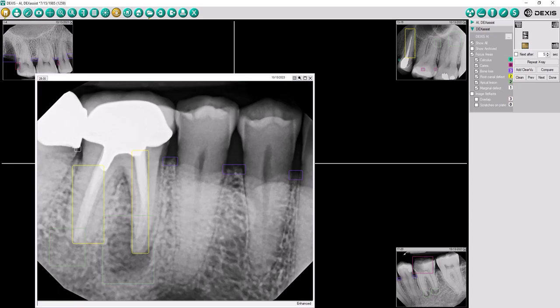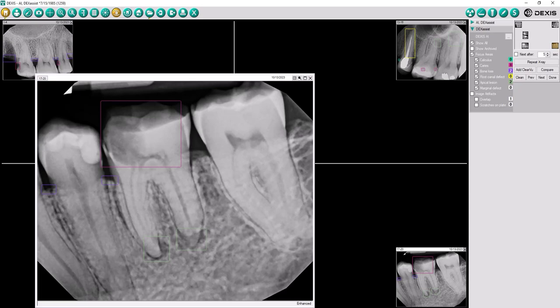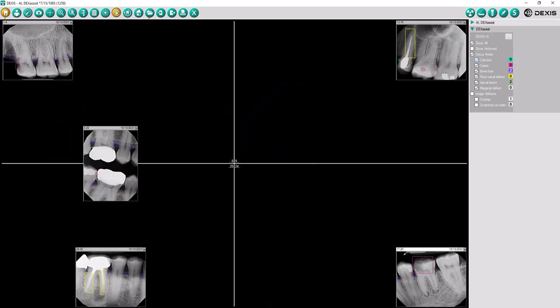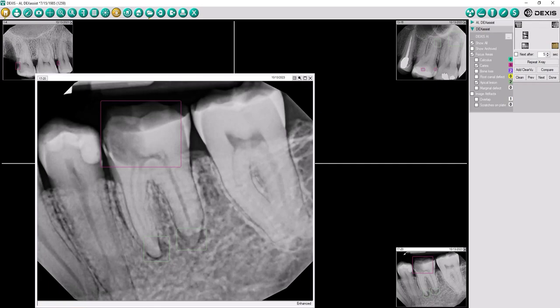Each finding is highlighted in a different color to help you quickly distinguish one finding from another. DexAssist solution is customizable depending on your preferences. For example, if you just want to see caries and apical lesions, simply deselect the other findings, making case presentations more focused for you and your patient.